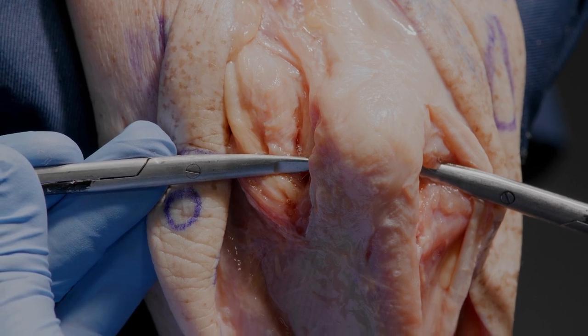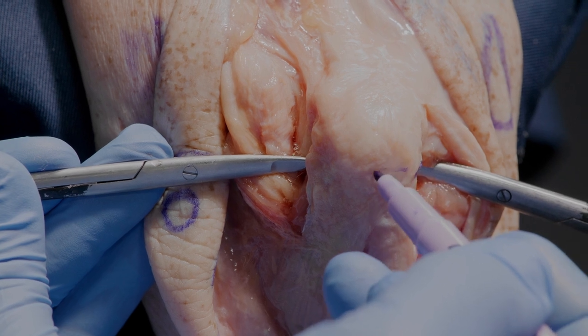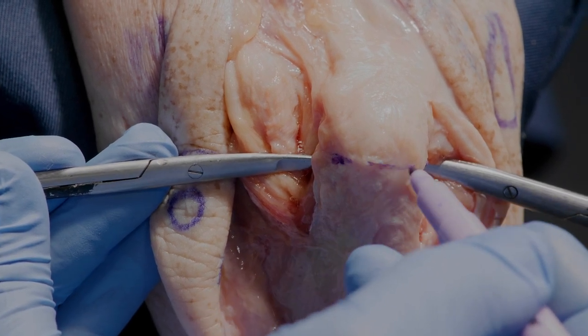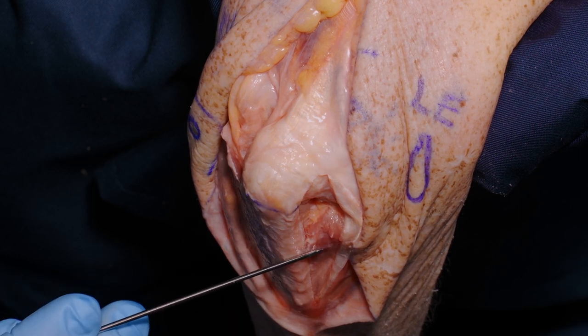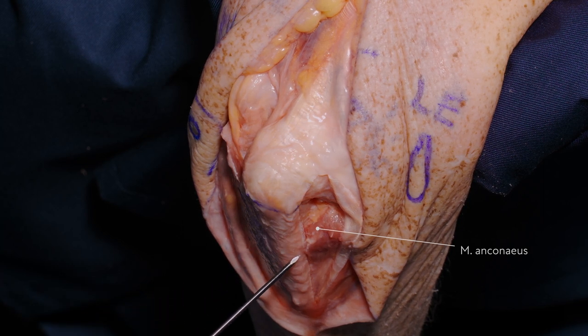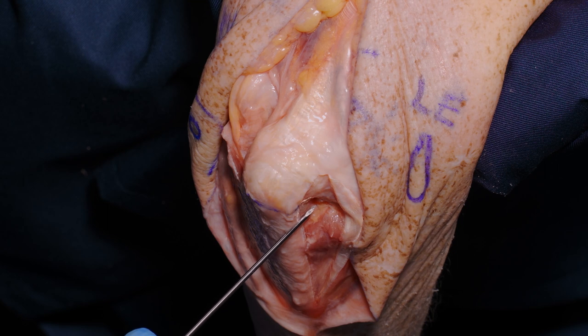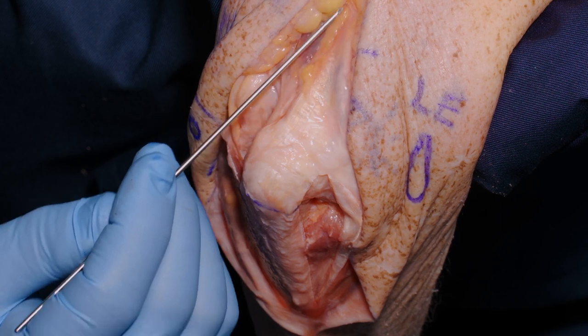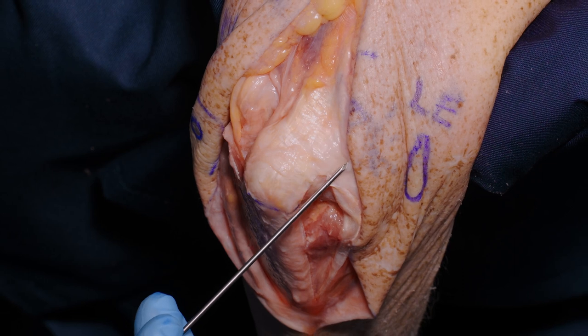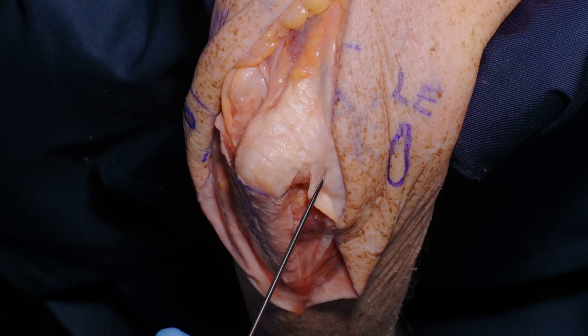We can mark that line with our skin marker across here. Our objective is to expose the distal humerus without unnecessary devascularization of important tissues, one of which is the anconeus muscle. This is an important muscle for elbow stability, and we want to preserve it in continuity with its nerve supply, which comes from proximal as a very long independent nerve, together with its blood supply from proximal.